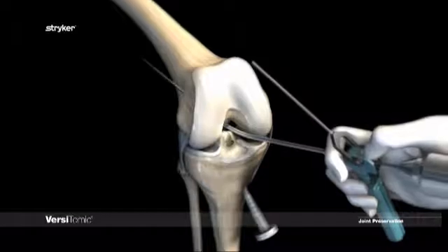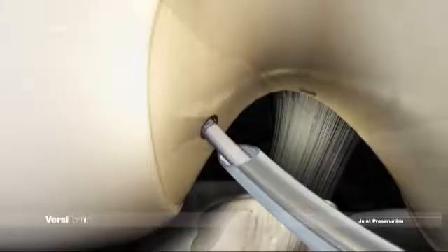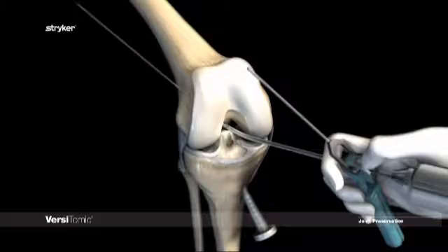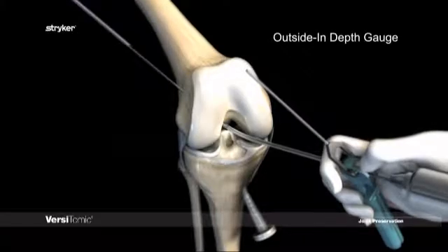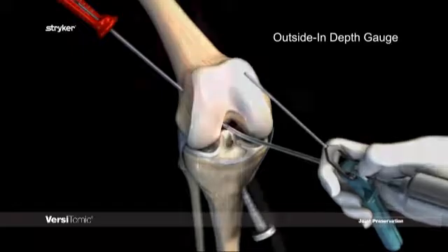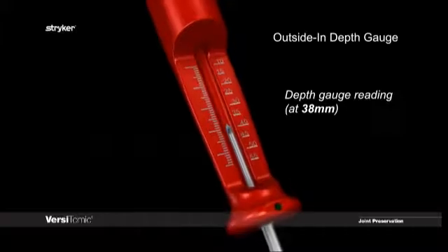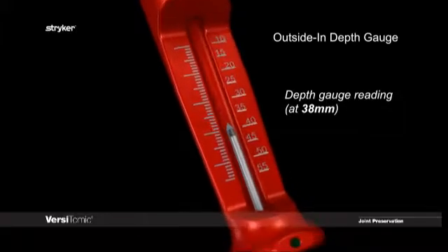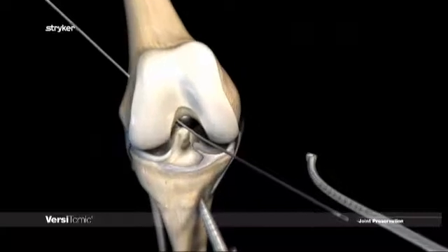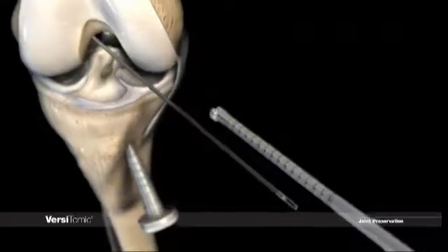Advance the pin until the line where color and finish changes from shiny to matte is flushed to the intercondylar notch. Make a small nick at the lateral exit point of the pin and slide the outside-in depth gauge over the pin until it meets the bone of the femur. The depth gauge reading is referenced to the very tip of the guide pin. After measurements have been taken, check the amount of flexible pin exiting the anteromedial portal to ensure the entire puzzle piece portion will be supported by the flexible pin.